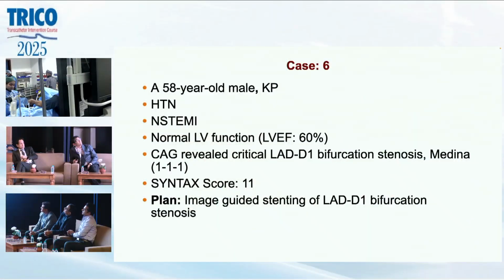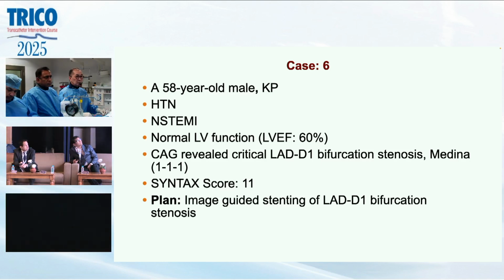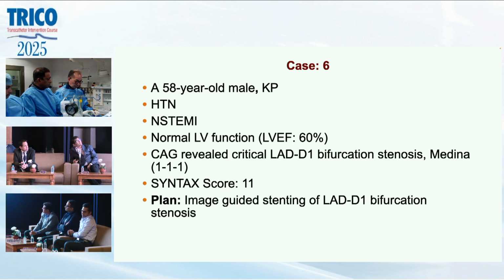Hypertensive, presented with NSTEMI with normal LV function. Angiogram revealed critical LAD diagonal bifurcation stenosis, Medina 111, with a SYNTAX score of 11. Today's plan is imaging-guided stenting of the diagonal bifurcation.